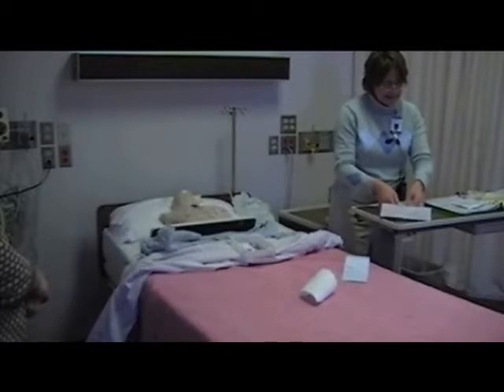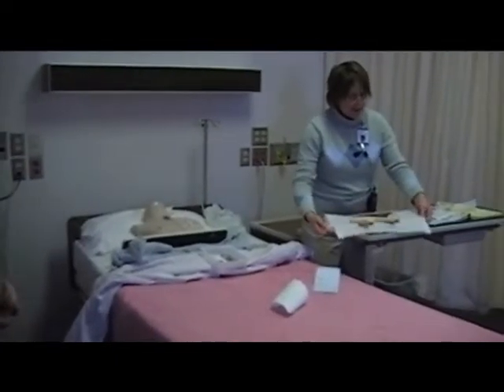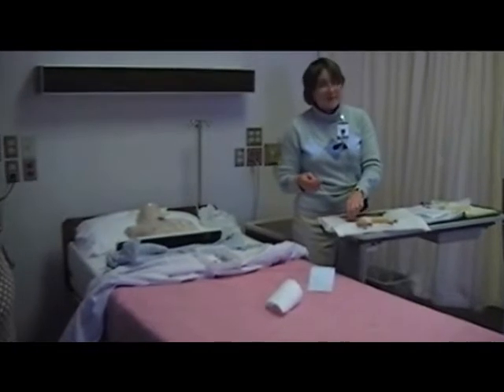...be using for cleansing his skin actually has been shown to be persistent on the skin for 2 days, and its effectiveness lasts for up to 5 days.